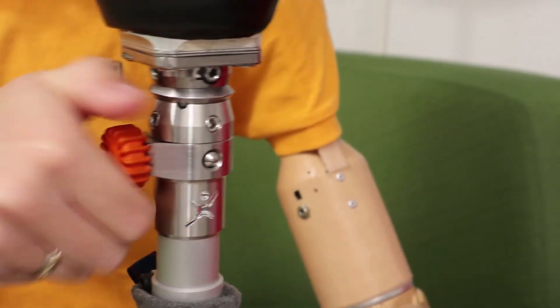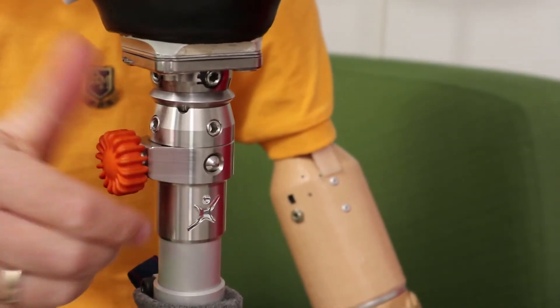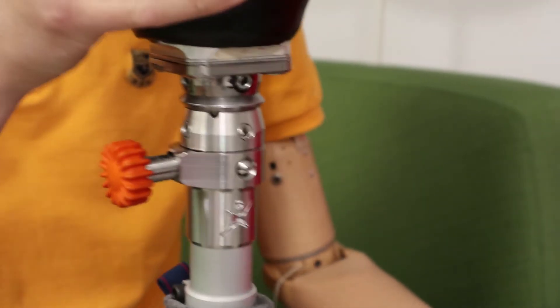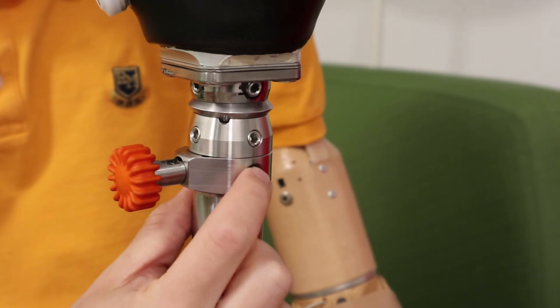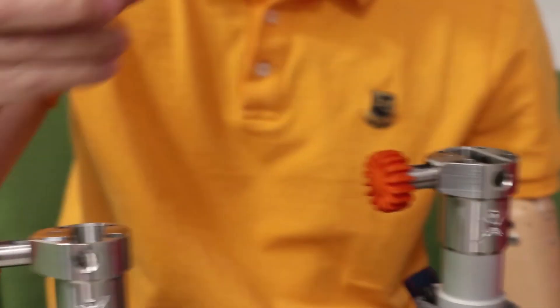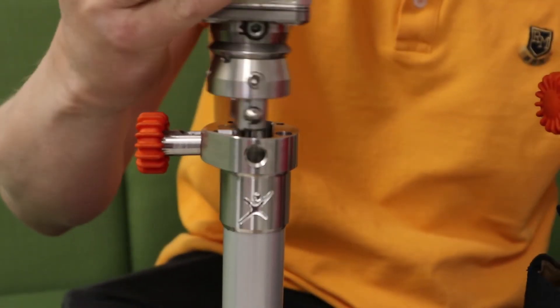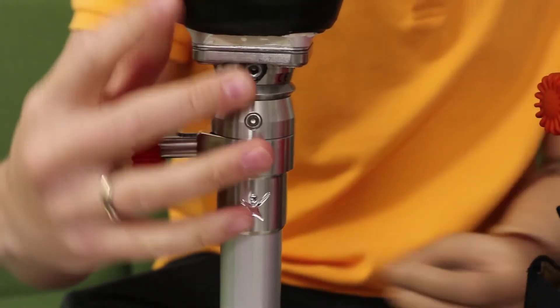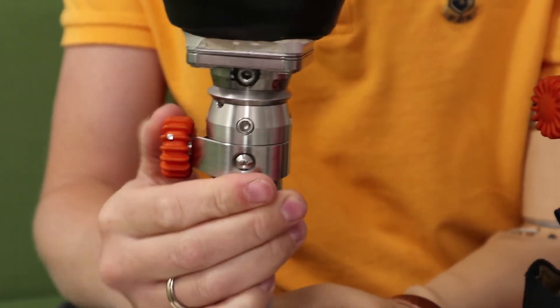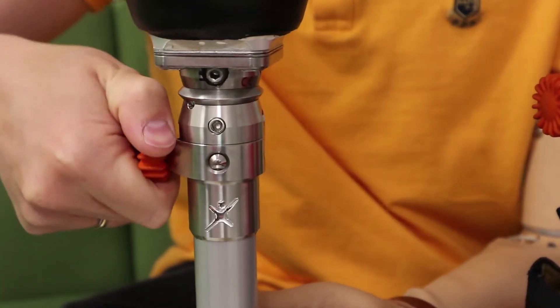Just untighten this like that and that one pops out. The legs are still connected so you need to push this safety button as well, like that. Then take your socket, take it on the next one and tighten. And now you're good to go.